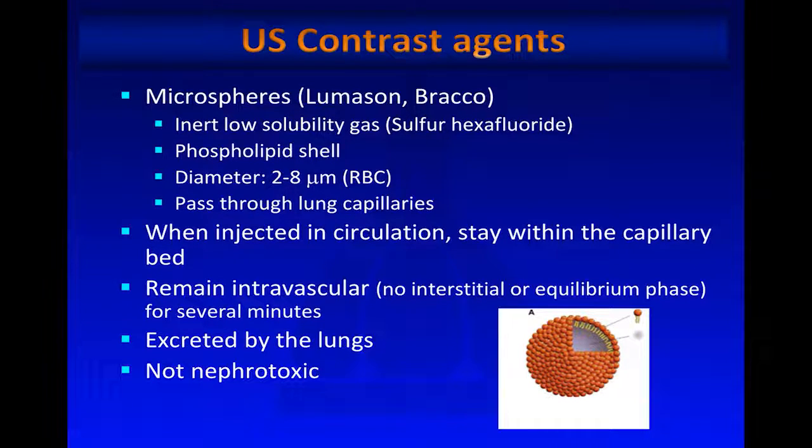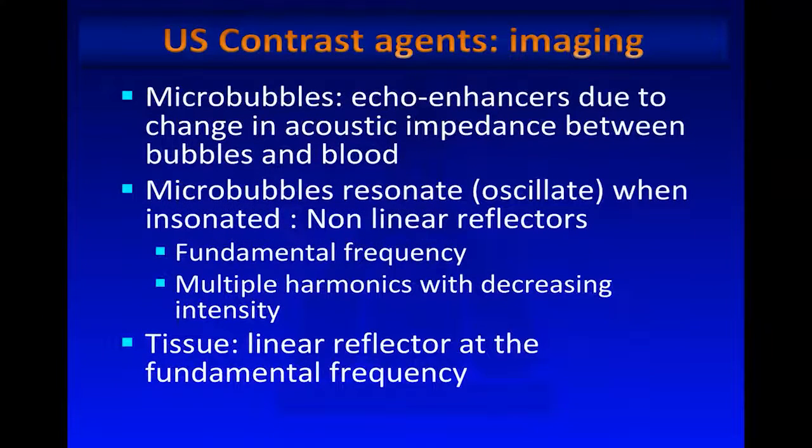Unlike CT or MR contrast agents, there is no interstitial or equilibrium phase, and they remain intravascular for several minutes. They're finally excreted by the lungs, or exhaled, and they are not nephrotoxic.